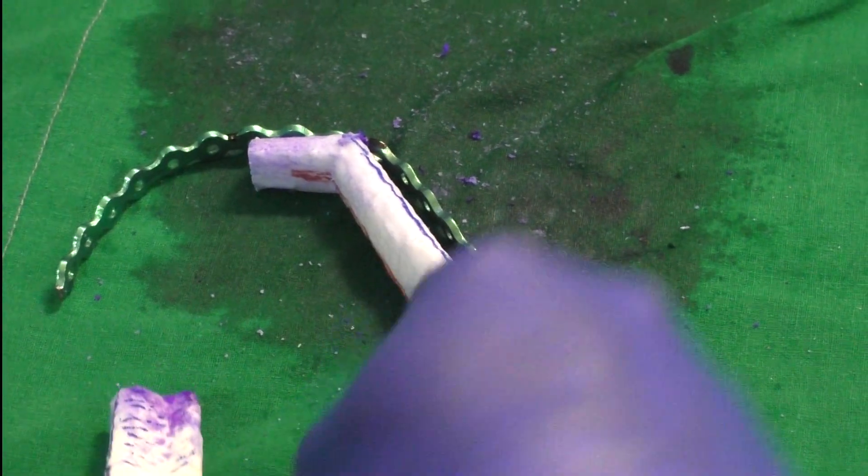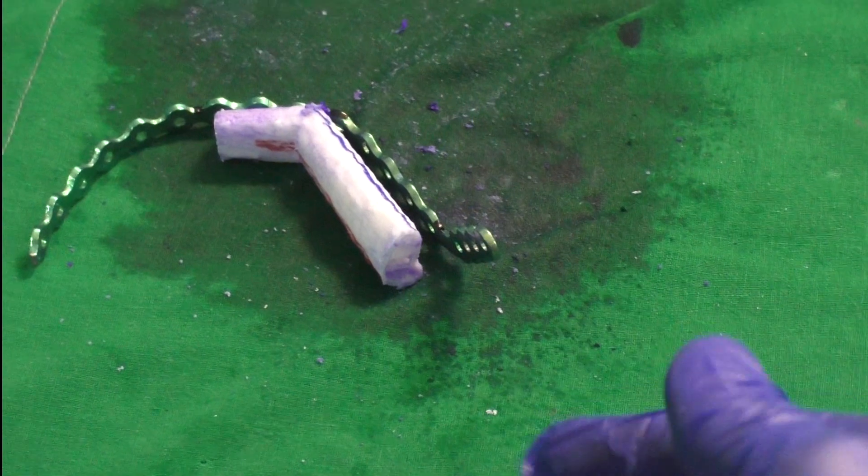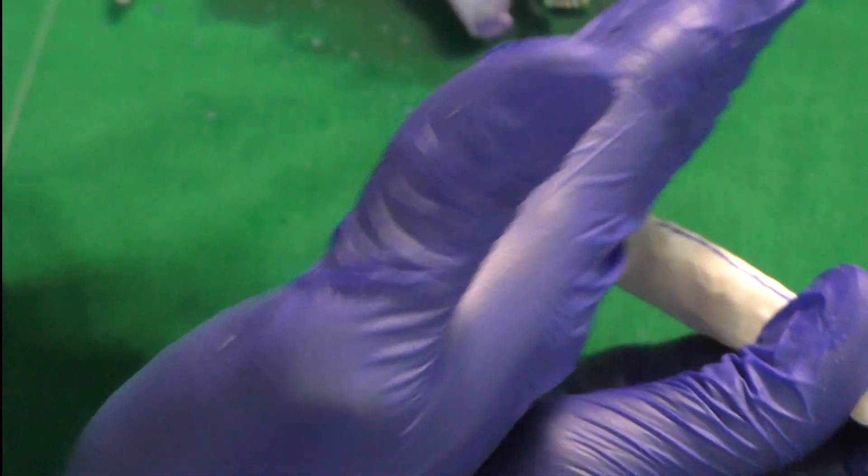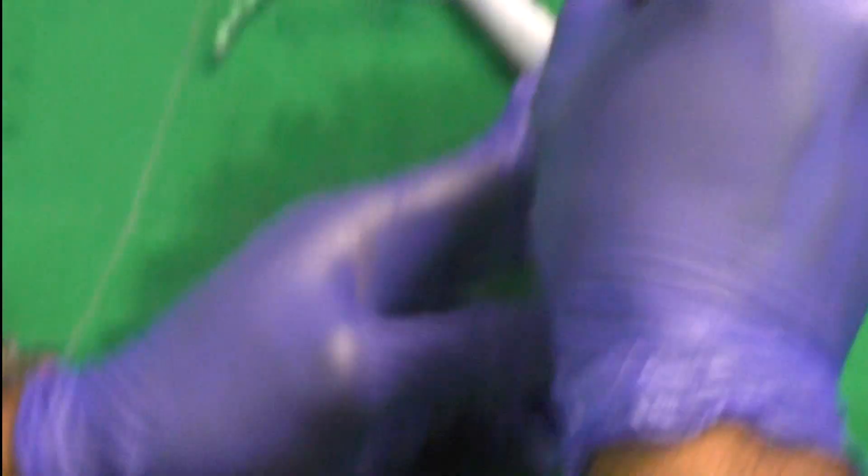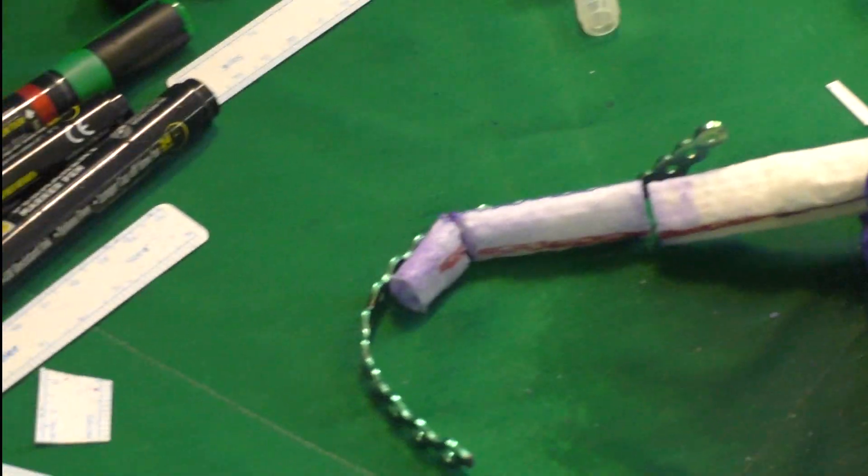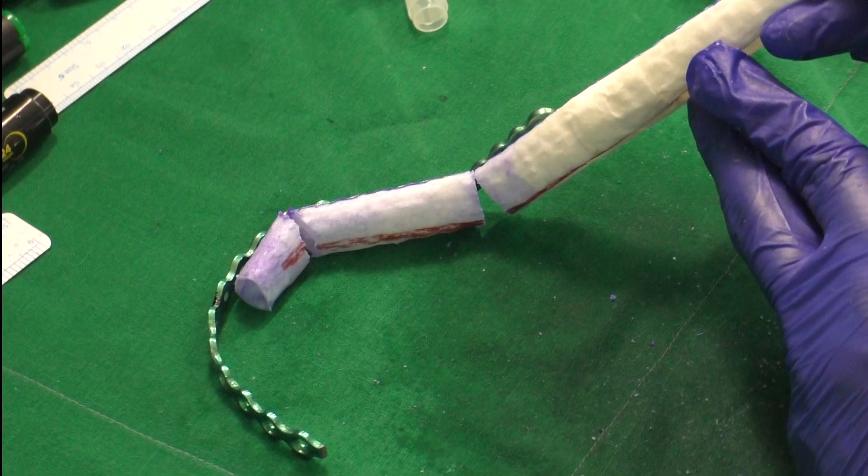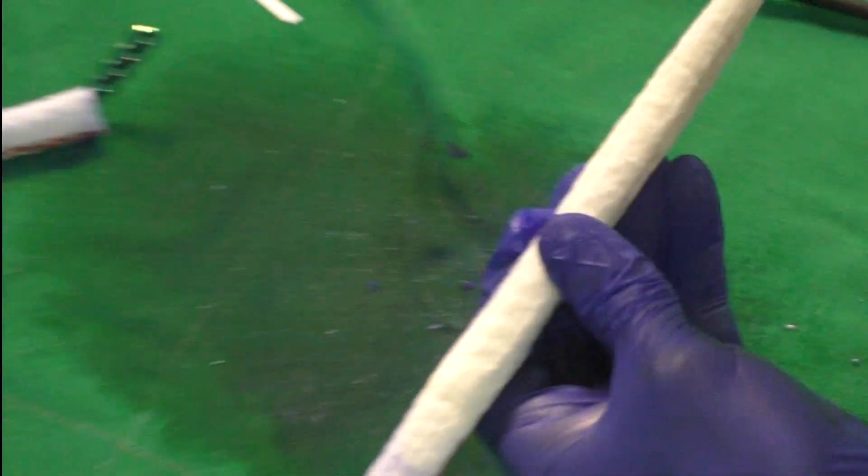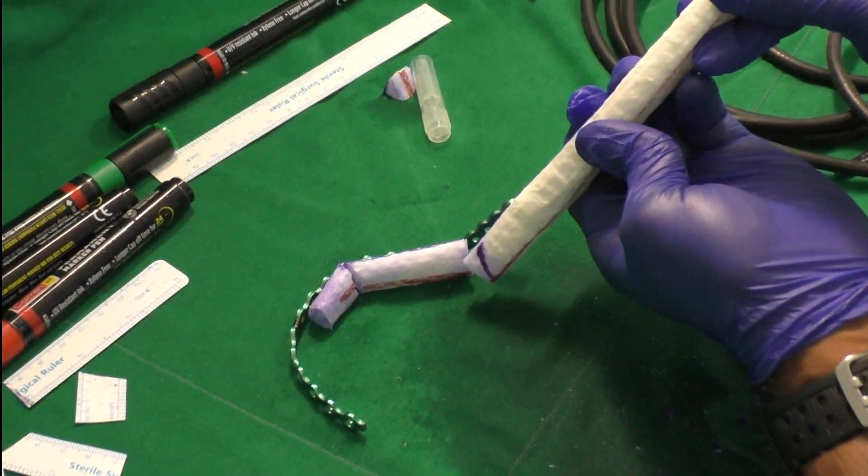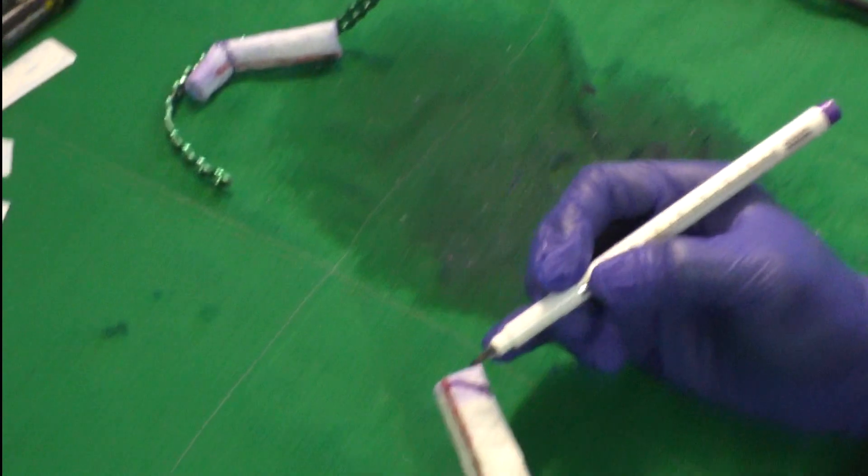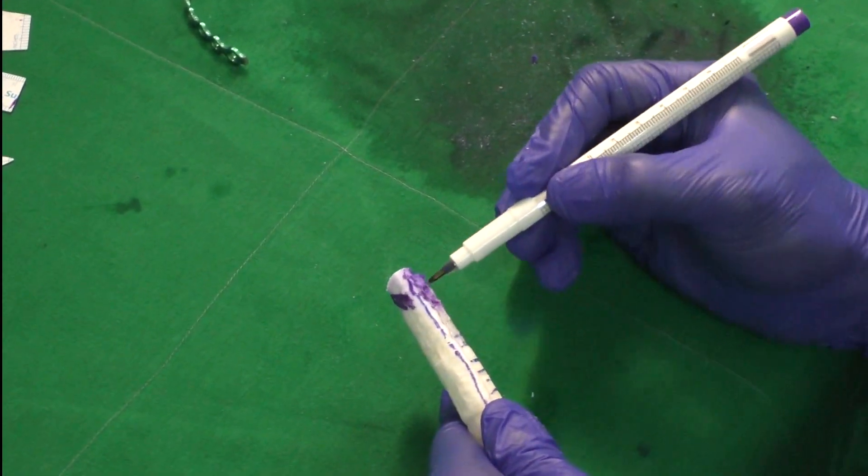Now if we need to do an ascending ramus reconstruction, what is the plan? In these cases, the base of the osteotomy is where the septum is attached, and the apex of the osteotomy is towards the inferior border, which is quite unlike what we did for a lateral segment. So to illustrate this in this video, this is the bone that needs to go in the ascending ramus, but we need to make contact by removing a piece of bone, and the best way to do that would be to keep the base of the osteotomy along the peroneal surface and where the septum is attached, and the apex goes to the inferior border.